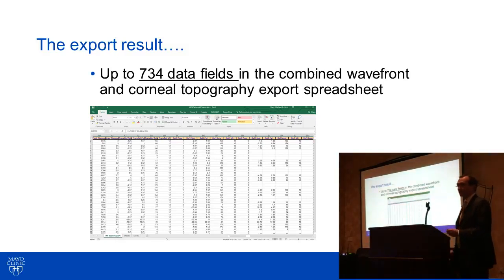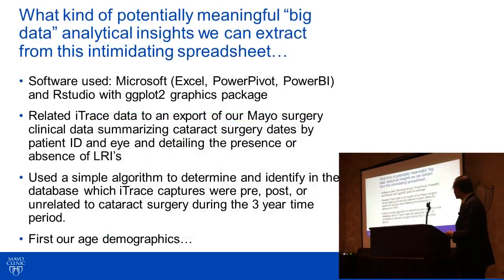This can be a little bit overwhelming in the context of manual data analysis, but for big data analysis, this really isn't so bad. But you have to know what to do with it. When we did our big data analysis, we used Microsoft Excel for the spreadsheets, but there's a Power Pivot and a Power BI package from Microsoft that, if you take the time to learn how to use it, makes it very easy to look at and manipulate big data. And then we used RStudio for statistical analysis and the graphing, and all this was done in the last week. So from a time intensiveness point of view, this is doable if you take the time to learn these tools.